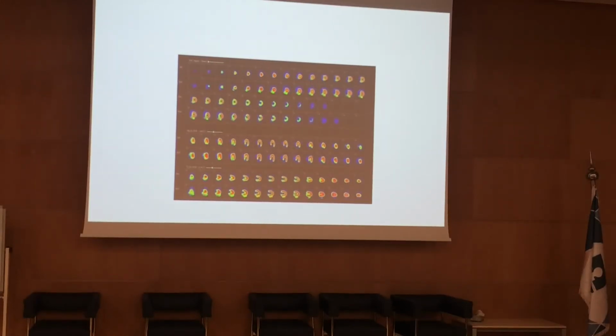How can we take the images? So we have to give him medication to stress him. So either to give him dipyridamole, adenosine, regadenoson, or dobutamine. These are medications that we give. So we give either adenosine, dipyridamole, regadenoson, or dobutamine.